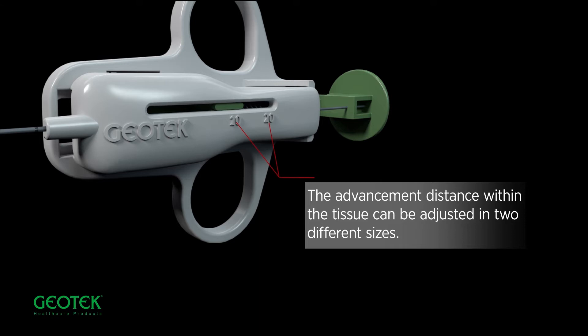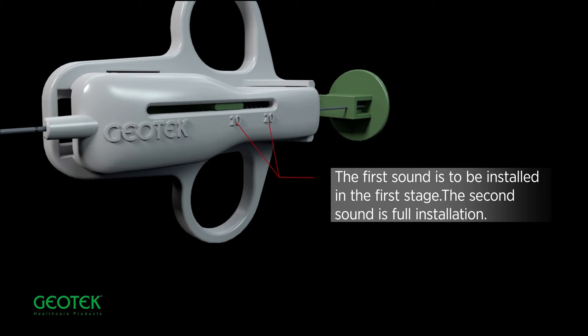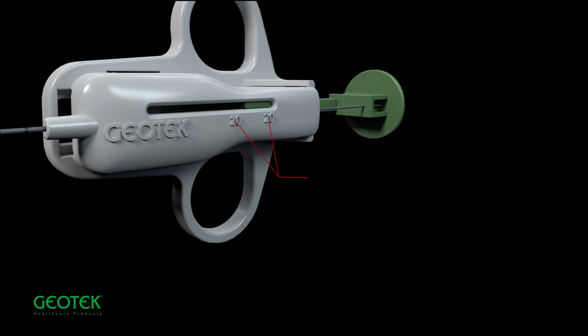The advancement distance within the tissue can be adjusted in two different sizes. The first sound is to be installed in the first stage. The second sound is full installation.